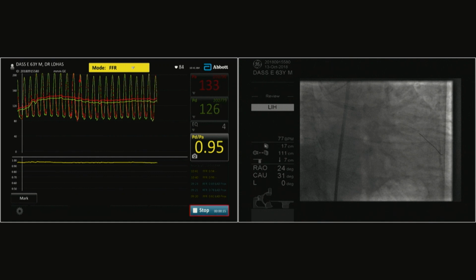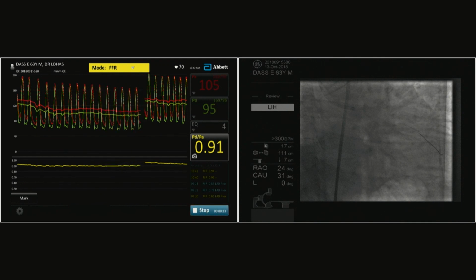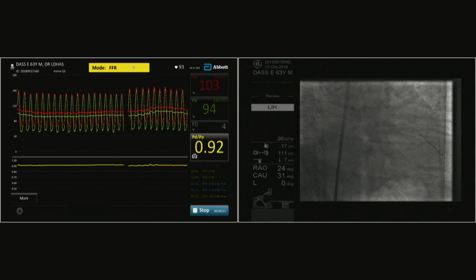To answer Ashok Seth's question earlier, I was pretty happy with around 8 in the LAD, which I assumed was a 3.5 stent, so 9.6, so we've got 8.2 as an MSA. And when you look at the confluence, it is more than 10, and when we come down, it's around 11. I think one of the reasons not to overexpand this artery is because the lesion is very eccentric, and if you start overexpanding these arteries, I risk a little bit of rupture. If you try to start expanding these calcified lesions eccentrically higher, we might even compromise our existing results.